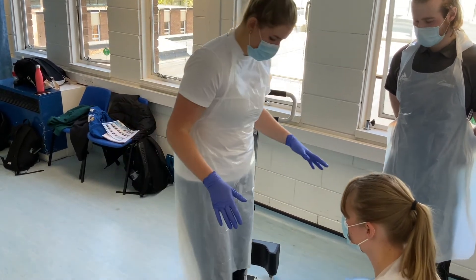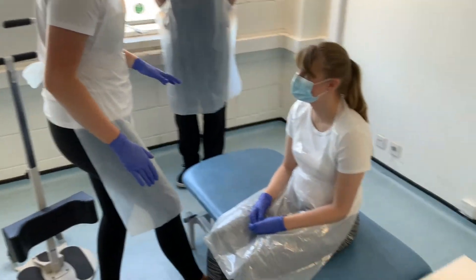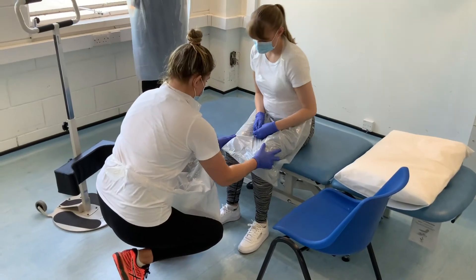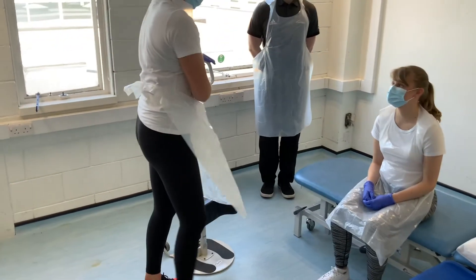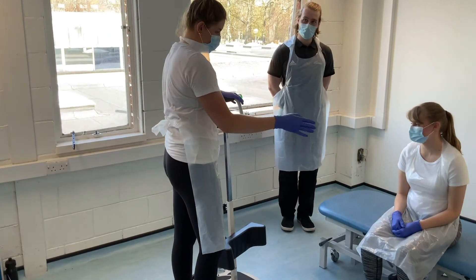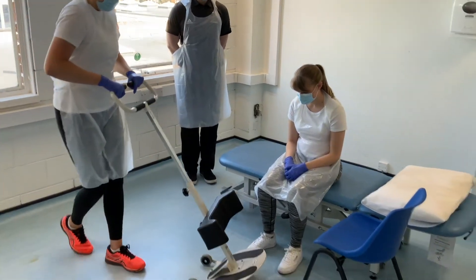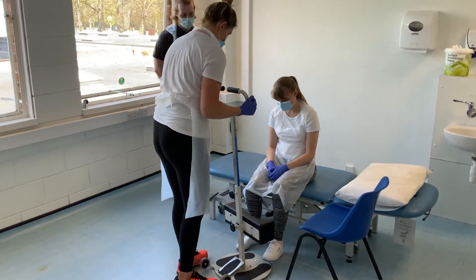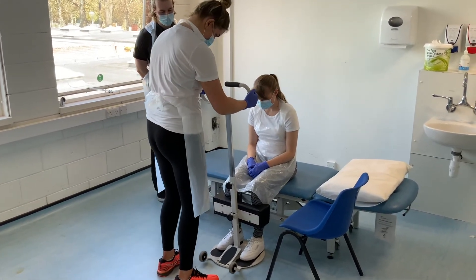So I'm just going to lower the bed just so your feet touch the floor. And I just want you to shuffle forward ever so slightly. So this is the rotary turner, which we're going to use to get you from the bed to the chair. So I'm just going to wheel this in — you need to just lift your feet ever so slightly.